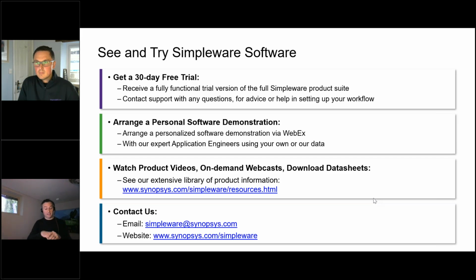There are ways AI can help. Even if it doesn't give you the exact model, if it's an 8-hour process to segment and the AI saves you 4 hours, then there's value there. So it really depends on your application. It always requires several conversations. It's not just here's a brochure and then you go license it. When we get into the custom area, it's definitely a lot of back and forth, and we work with you to figure out how we can help you most effectively.